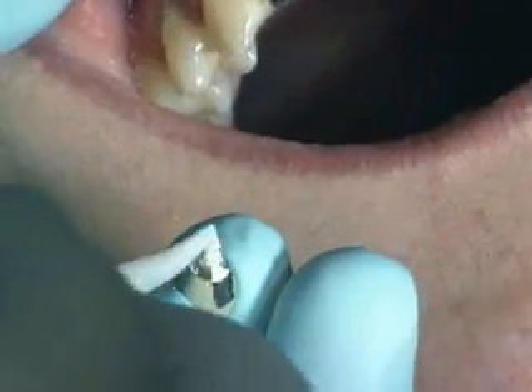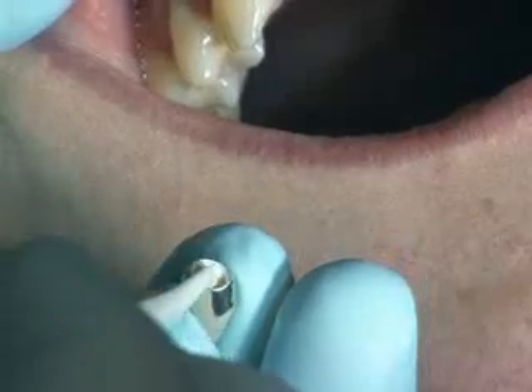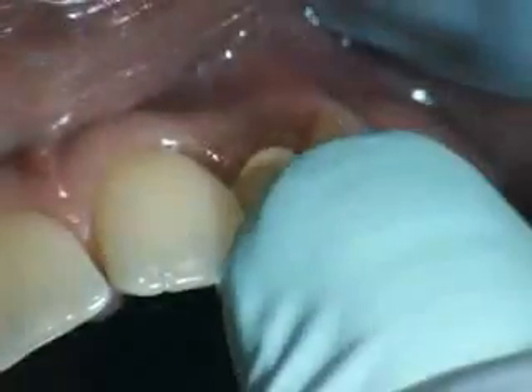In the final step, the ceramic veneer crowns are definitively cemented on the insertion site.